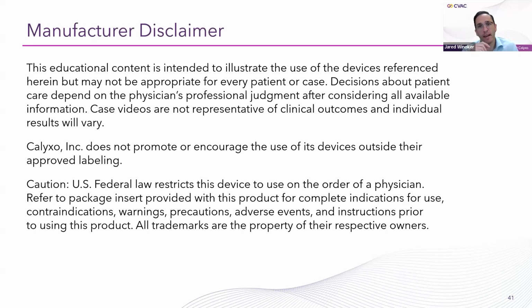And frankly, I use that internal stylet as kind of my tipping point about whether I think this is going to be a CVAC or if I'm going to do a traditional ureteroscopy, or if the discussion was preoperatively that it's CVAC or bust, then it's the stent and come back another day to place the access sheath. And there have been cases where I can get the internal stylet up, but I'm not able to get the full 14 French sheath up. And those have been the cases where I've more and more been dabbling with a sheathless procedure.